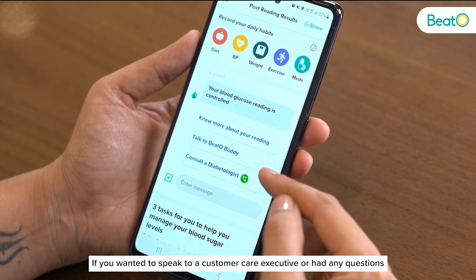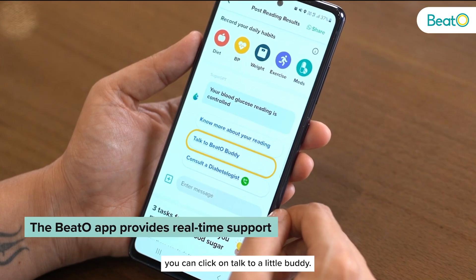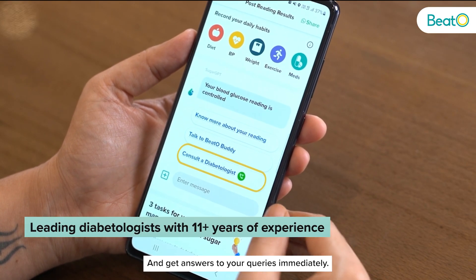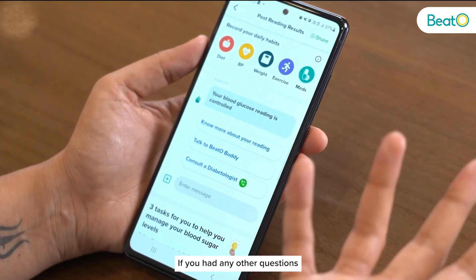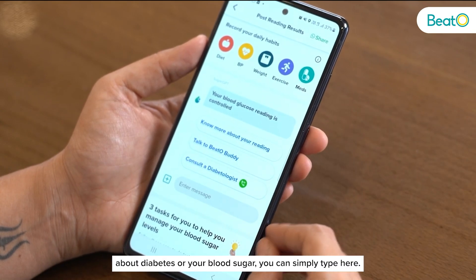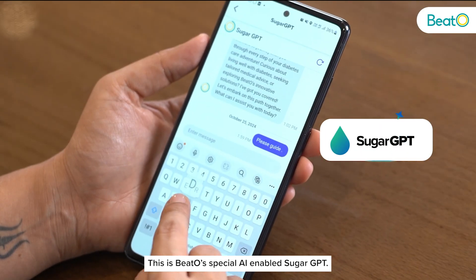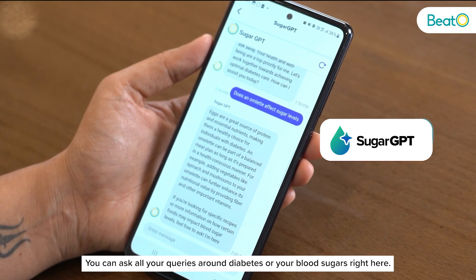If you wanted to speak to a customer care executive or had any questions, you can click on 'Talk to a Beto Buddy.' If you wish to consult a doctor for any queries, you can click on 'Consult a Diabetologist' and get answers immediately. If you had any other questions about diabetes or your blood sugar, you can simply type here — this is Beto's special AI-enabled Sugar GPT where you can ask all your queries around diabetes or blood sugars.